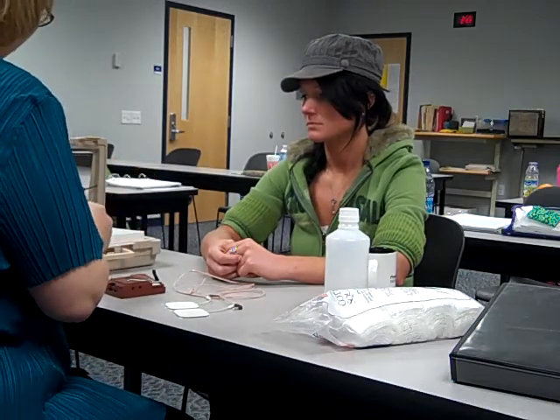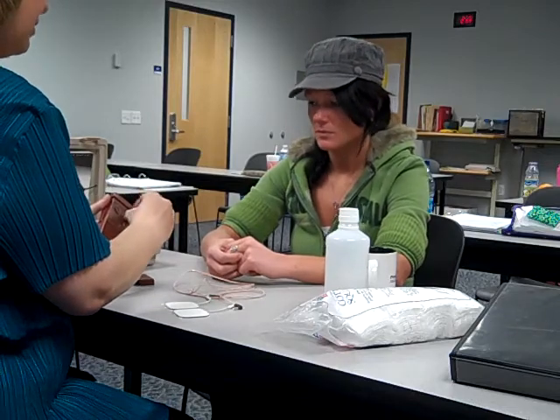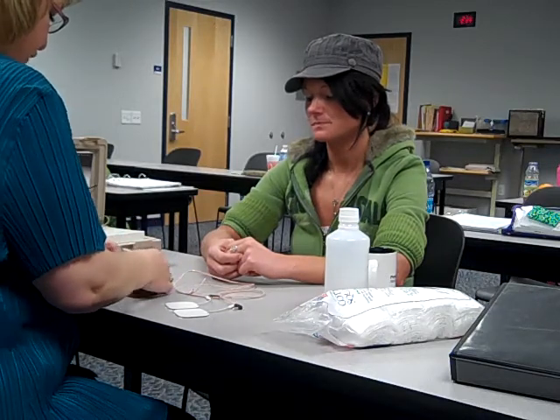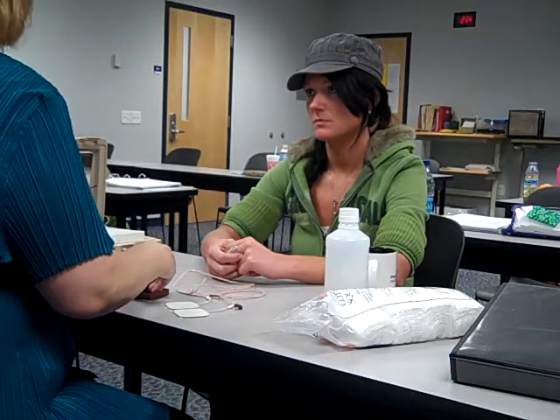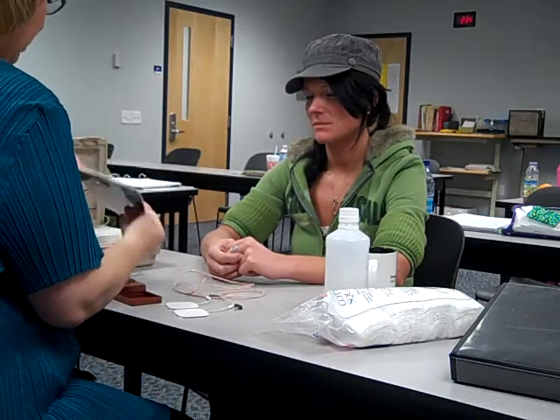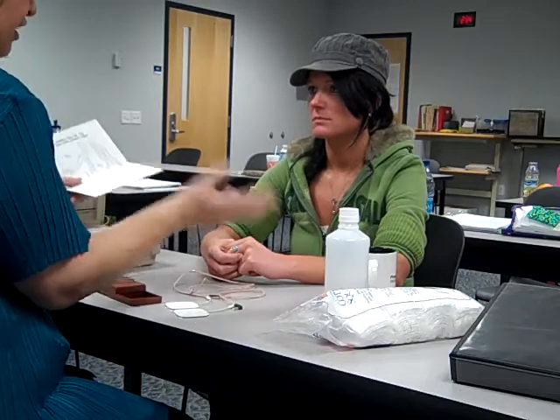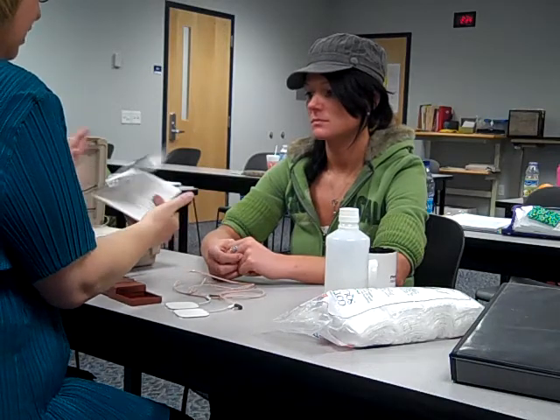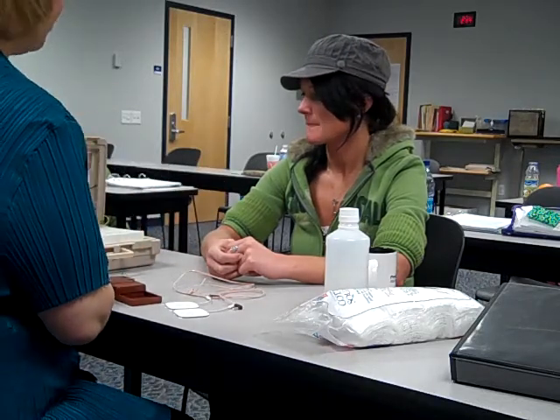Other things you're going to see here — there's a little round knob. That goes over the areas we'll be setting. You shouldn't need to change it, but just so you know what it is. I'll write those settings down in the booklet in case someone at home — like kids — messes with it. I'll also draw exactly where your electrodes are going on your forearm so you know where to replace them after a shower. There's a troubleshooting guide and a 24-hour manufacturer hotline you can call with questions. It's a nice little booklet to read through.